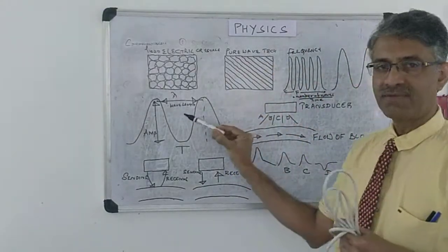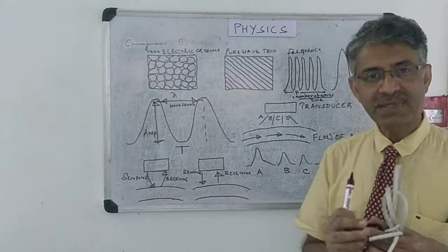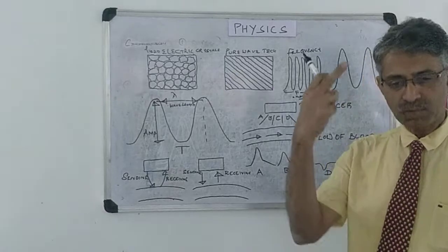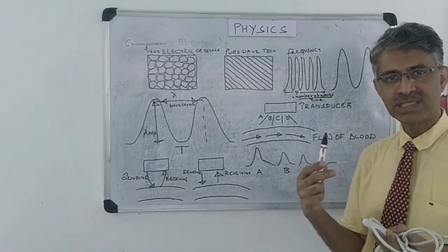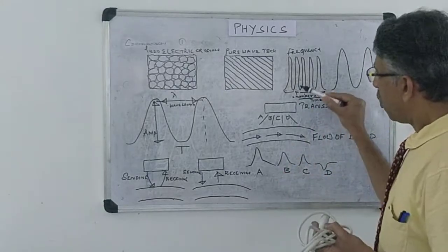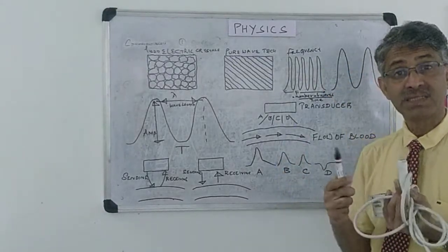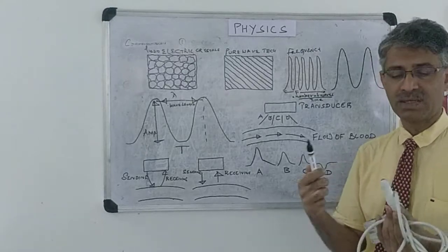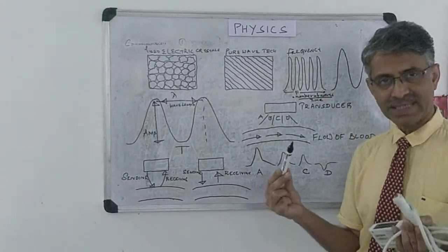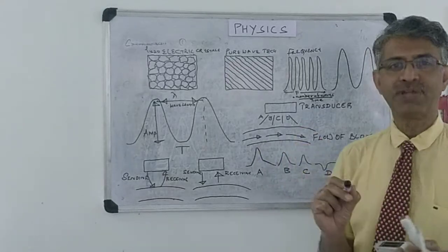This is very essential for any person who does the ultrasound because of the usage of the transducer. In neonates, because the chest wall is too thin and the whole body is thinner, fat content is very low, we need more resolution, not the penetration. To get a higher resolution image, we need to use higher frequency probes. So that's the reason we sometimes use anything more than 4, 10, 12. So the higher frequency probes we use in neonates. In adults, because the fat content is high, we need more penetration, and more penetration means you need to use low frequency probes.